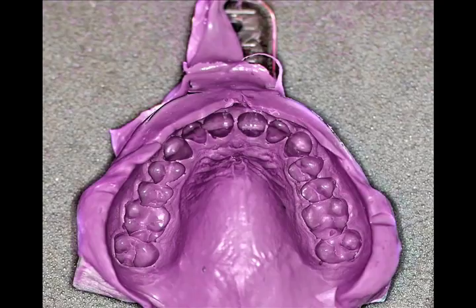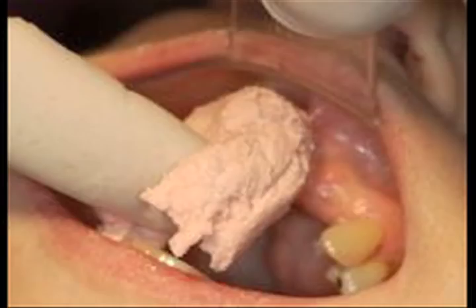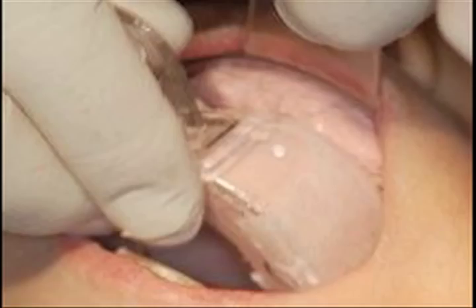When taking an impression for an immediate or partial denture, it is essential to capture the labial fold. With the fifth hand in place, impression material can be placed onto the retractor and the tray sandwiched onto it. The retractor is removed before the impression material sets and the lips manipulated into function to contour the material and muscle pulls. Alginate is being used here to take an impression for an immediate denture.